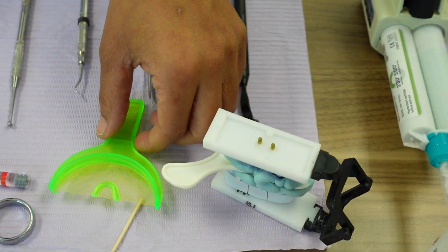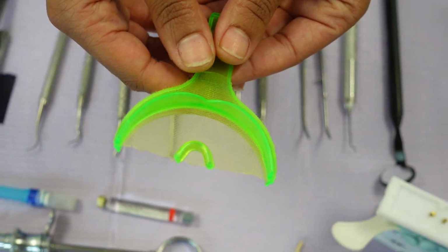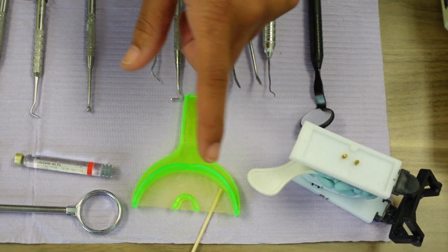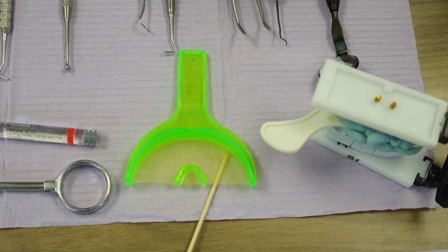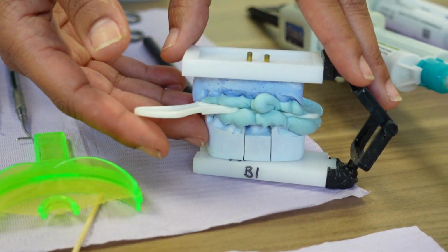This is a tray that we use for a preliminary, which means before the final impression. That's actually for an anterior tooth, if we're doing an anterior tooth, 8 or 9 or 24, 25. Now we're moving on to the crown prep stuff.